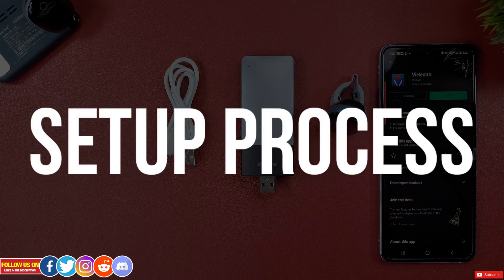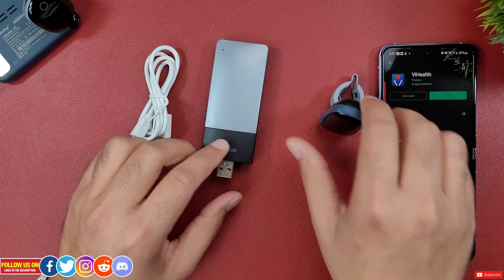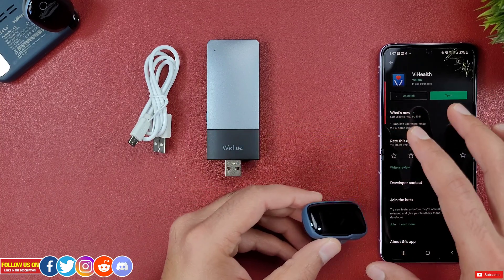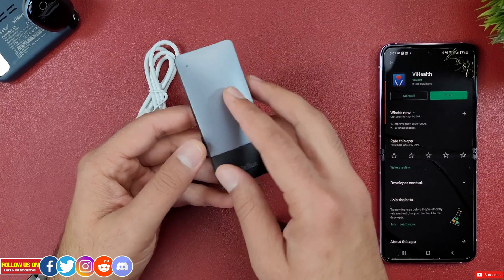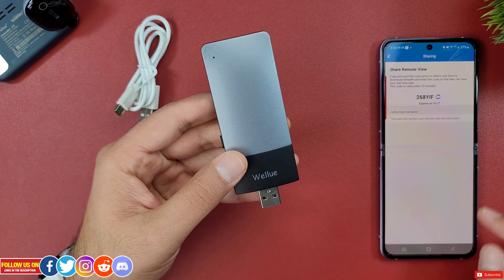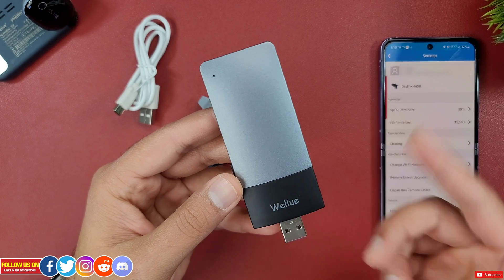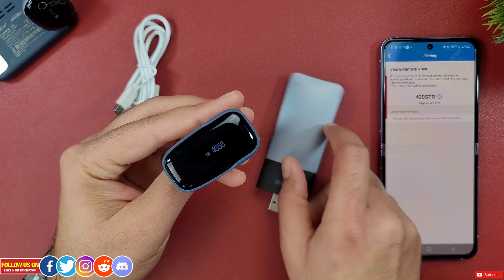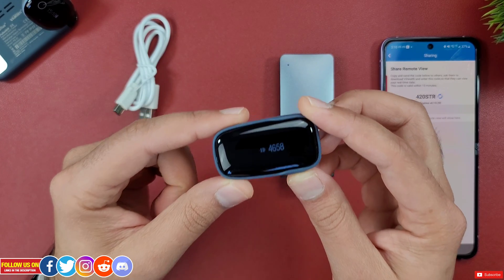Before the setup process, let me briefly explain how this OxaLink works. Basically, the OxaLink connects to the phone via the V Health app and shares data to the remote linker via a linked online account or Wi-Fi. Anyone who gets the code generated from the remote linker can view all the vital data in real time and also receive alerts. This makes the difference between the OxaLink Basic and OxaLink Remote quite apparent.